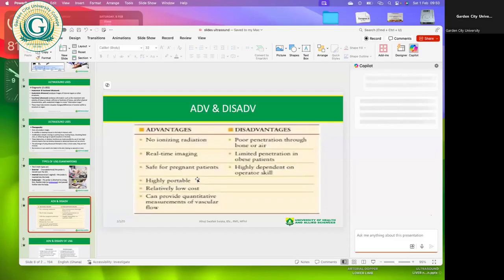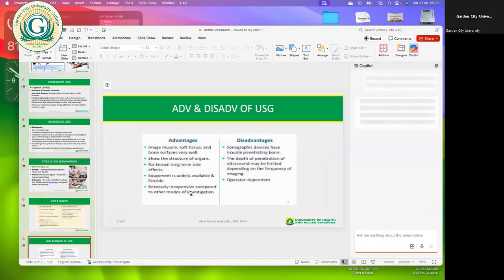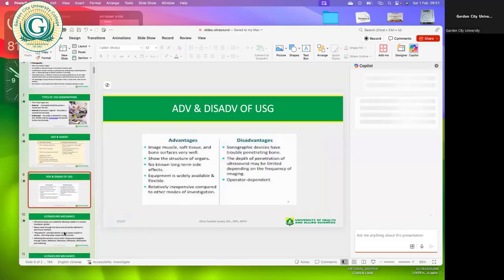So again, two of the mediums that ultrasound finds it very difficult to propagate in are bone, which is very dense tissue, and air, which is very undense. When we take bones, for instance, they absorb all the ultrasound that is sent to them. We'll get to its significance shortly. These are some of the other advantages and disadvantages which you can read in your own free time.